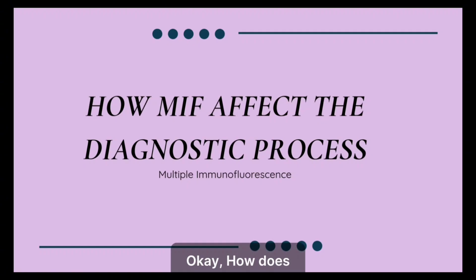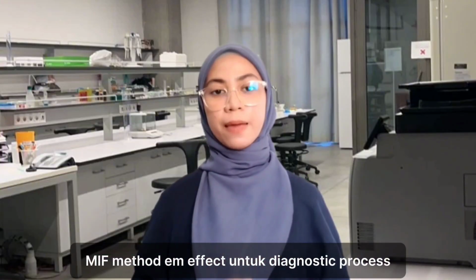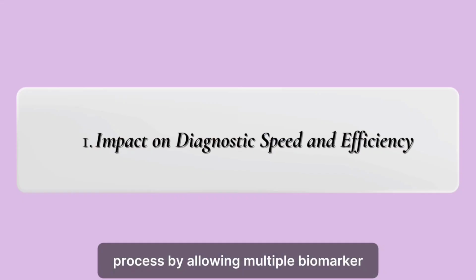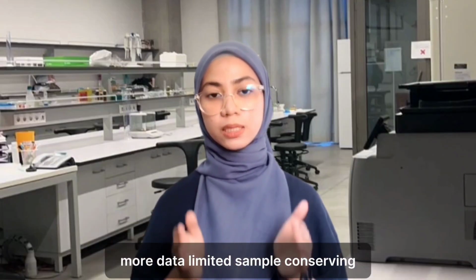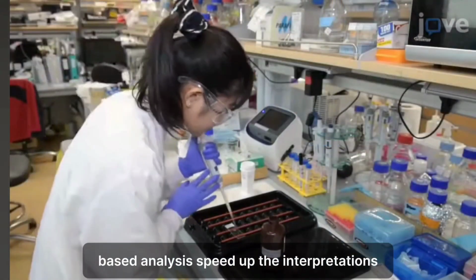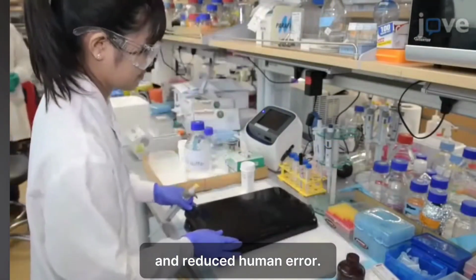How does the MIF method affect the diagnostic process? The MIF method speeds up the diagnostic process by allowing multiple biomarkers to be analyzed from a single tissue sample, reducing the need for extra tests and ensuring more data from limited samples, conserving the tissues, and providing detailed images combined with AI-based analysis to speed up the interpretations and reduce human error.